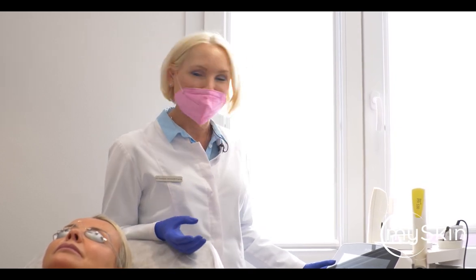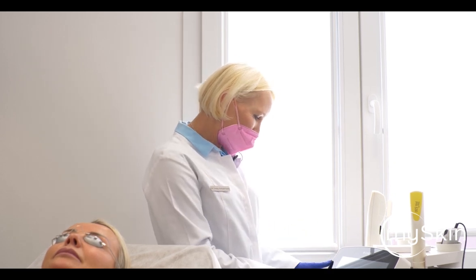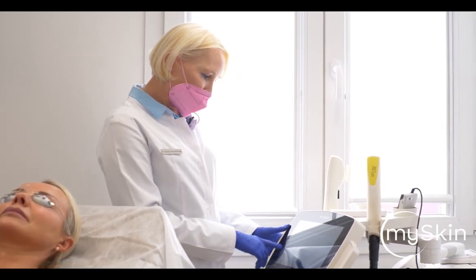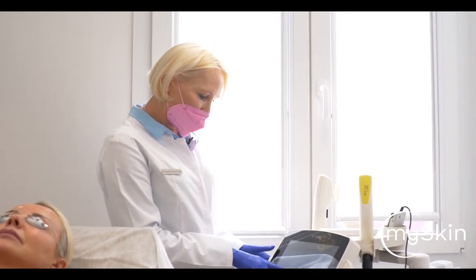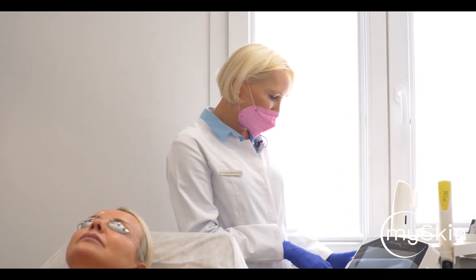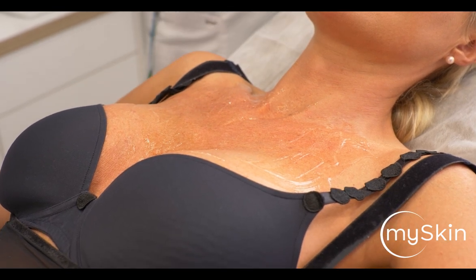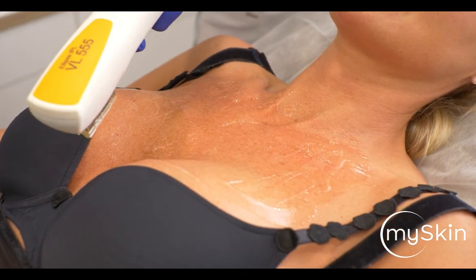This is what we experience all the time from our patients, because they are still spending time in the sun but always protected. So it's skin type 2 with a low suntan, and we choose the diffuse redness and pigment mode with a double pulse — 9 joule divided in two pulses with a 10 millisecond delay. On the chest, we always need to be a little bit careful because the skin is much more delicate, so I always do a test.